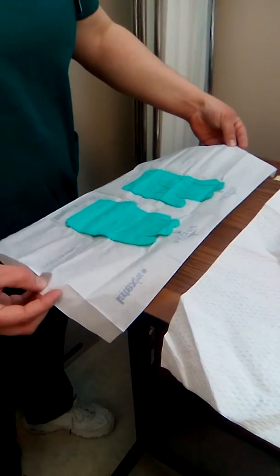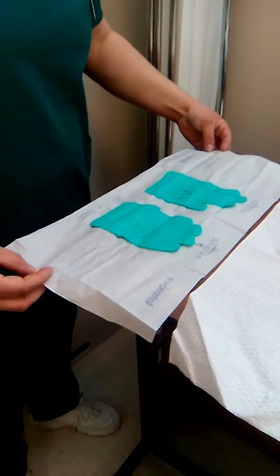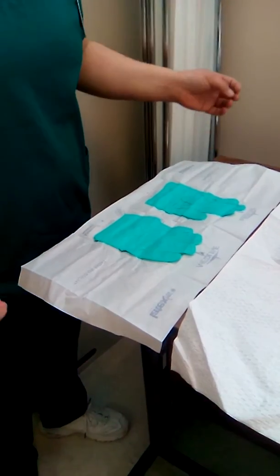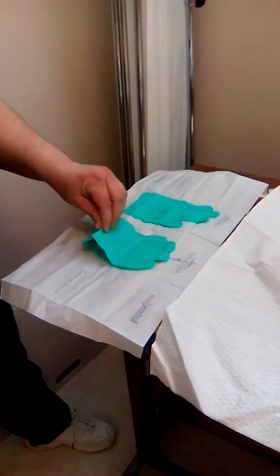Ensuring that my paper does not cross over my sterile field, otherwise it will be contaminated. I am going to apply my first glove.